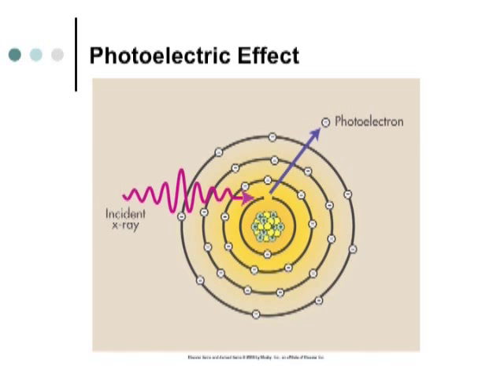That will result in what kind of an image on the film? Black or white? White. Photoelectric effect, we strive for photoelectric effect. We want the film to be either black or white, unless we're doing a chest x-ray, and then we want a longer scale of contrast. But for the most part, we set our kVp so that the x-ray will either be absorbed by the patient, giving us contrast, white, or go through the patient, giving us black.